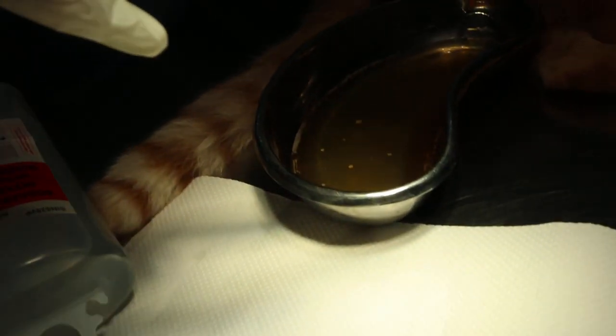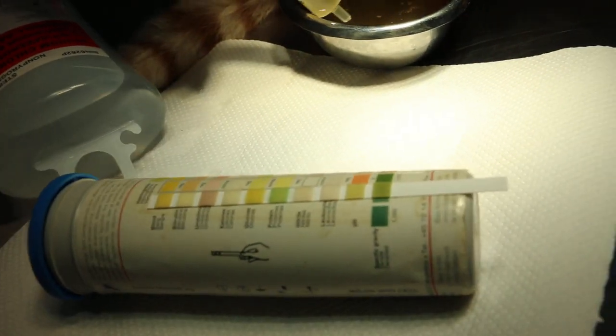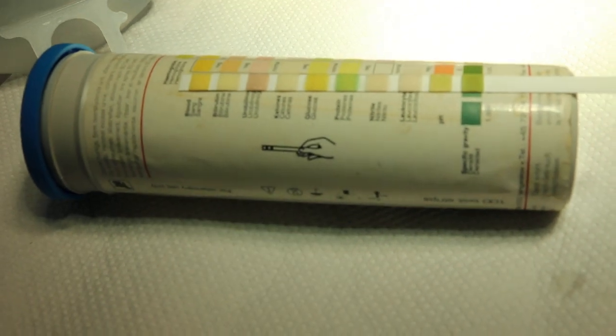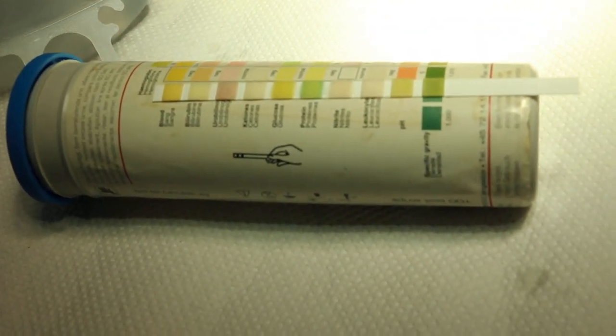Protein, definitely there is. Protein is one plus. When I flush in, sandy. Sandy, yeah, that's right. So this is very common, the sand, urinary sand. Now we can feel for the stones. Any stones you can feel? So there should be no stones, no big stones.